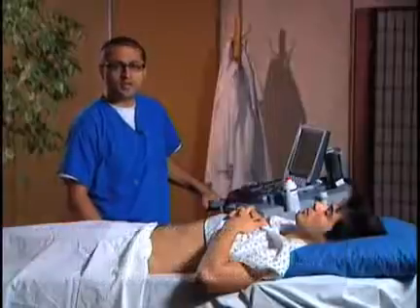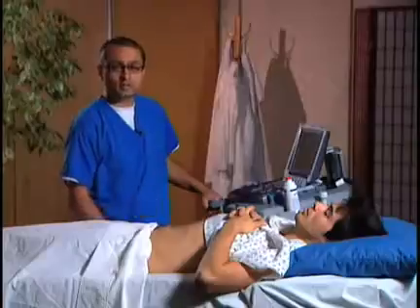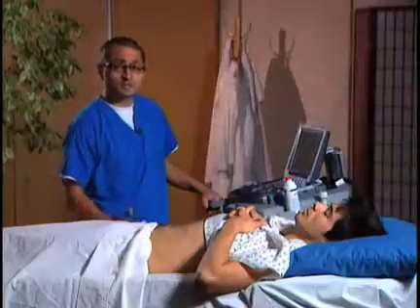Okay, I'm going to take you through the gallbladder exam. So in the emergency department, you may have a patient with abdominal pain. The question is, who are you going to do a gallbladder exam on? The patients that you suspect cholecystitis or biliary colic are the ones that we're going to primarily be doing this exam on. The exam setup is very straightforward.